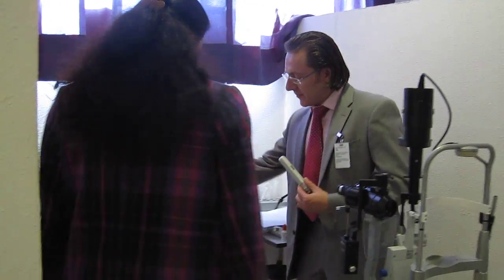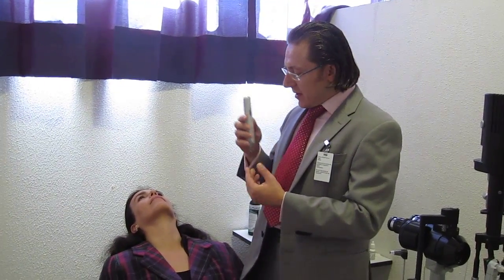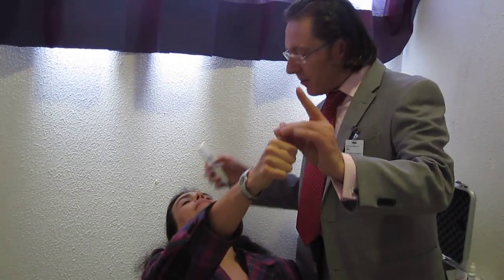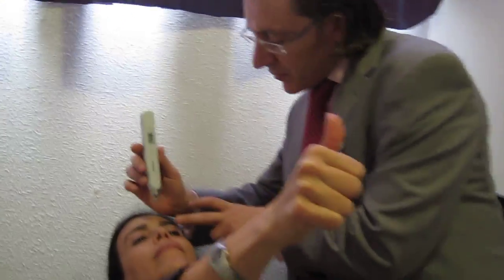Let me demonstrate how this device operates. We'll have a patient, please. We use a regular chair for the patient. Hold the device with one, two, three fingers. Position the patient with the head tilted back and extend the thumb. The thumb allows us to make sure the eye is centered. I would use the edge of my palm for support on the patient's forehead.